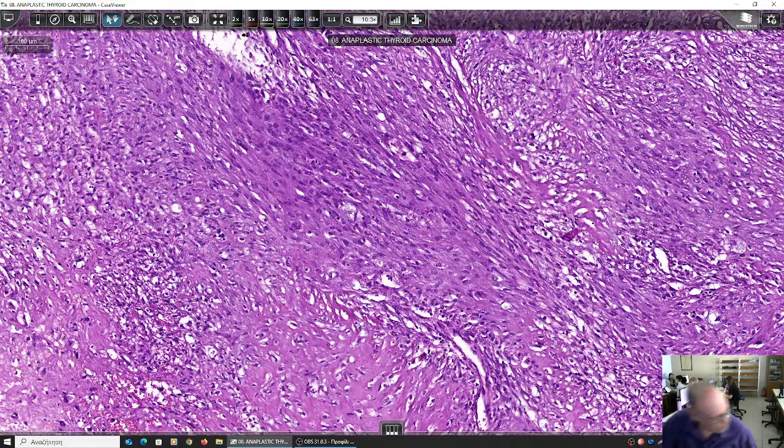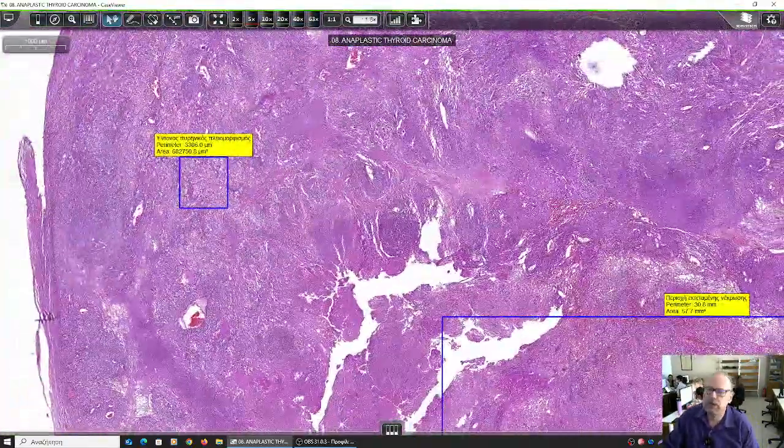If it comes from fibrous tissue, yeah, fibrous. It's a sarcoma, a malignant tumor of mesenchymal origin, of mesenchymal tissue. For example, from skeletal muscle, rhabdomyosarcoma, from smooth muscle, leiomyosarcoma, from fibrous tissue, fibrosarcoma, from neural tissue, neurosarcoma, all this. Okay. So it doesn't help me at all.